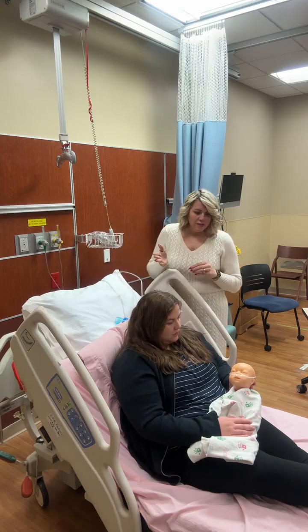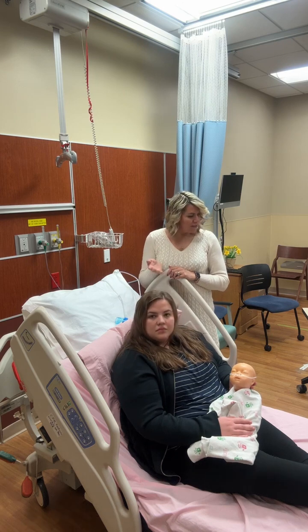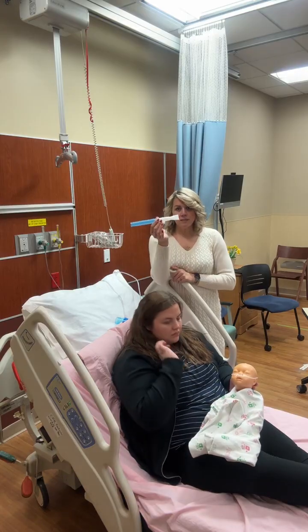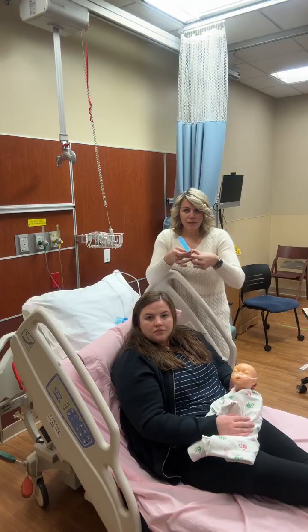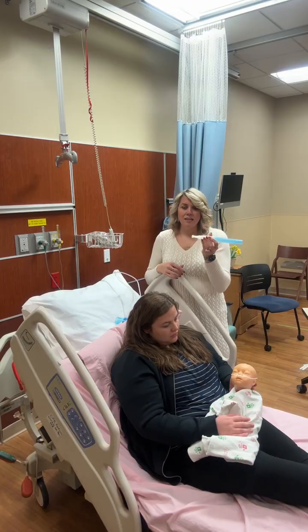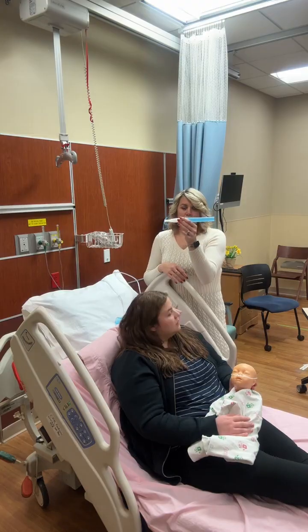Now we're going to talk about giving a nebulizer to an infant. And so in this situation, when we're trying to figure out how we're going to do that, this mouthpiece would not be appropriate to use because the baby cannot keep a seal on the mouthpiece. I mean, it's not going to stay in the mouth. They're not going to breathe in and do a breath hold properly for this to work.